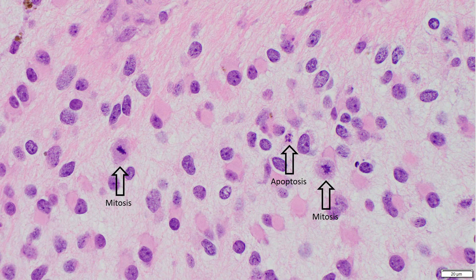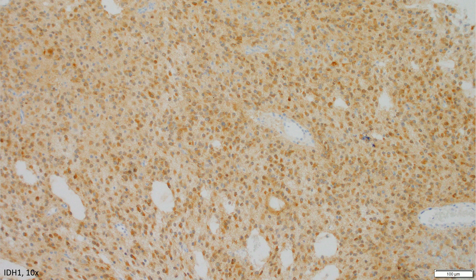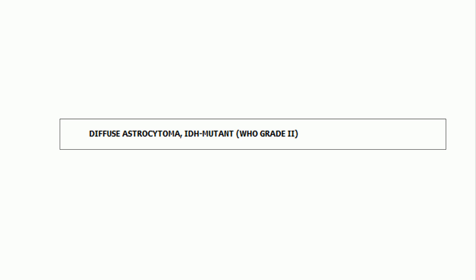This particular tumor is positive for GFAP and also positive for IDH1. This is an immunostain highlighting the mutant protein of the most common IDH1 mutation, the R132H mutation. So this is a tumor that is a diffuse glioma — an astrocytoma based on the amount of atypia, which is not that much; based on the amount of mitotic activity, which is not that much; and based on the IDH mutation status, which is present. The diagnosis for this tumor is a diffuse astrocytoma, IDH mutant, WHO grade two.